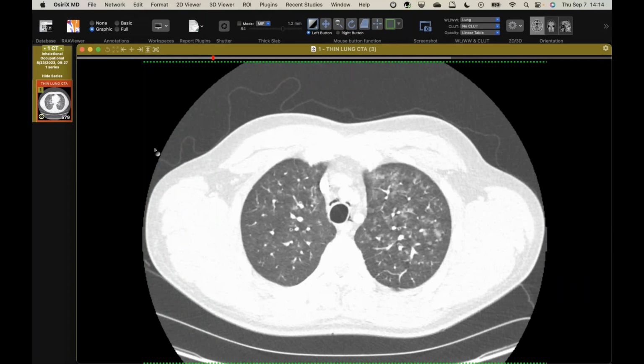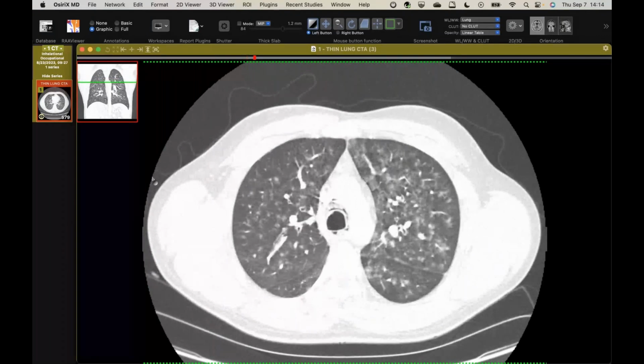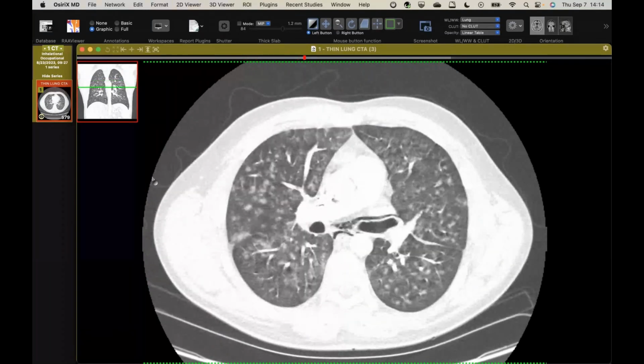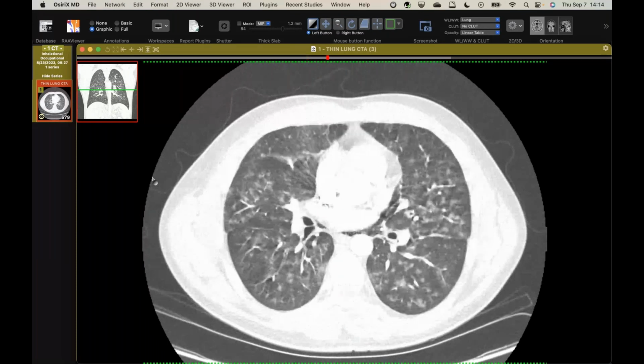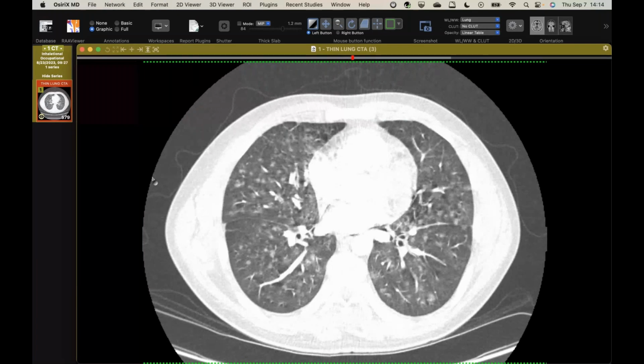It can be caused by exposure to certain metal oxides, but it's sort of a vague term. They get this systemic response, and they can get a little hemoptysis, and they can present with this centrilobular pattern, sometimes a little bit of edema. I presume the pneumomediastinum was just a Macklin effect from a lot of coughing, but I don't know. I haven't seen really any cases of metal fume fever, but this seemed to fit the bill. So a presumptive diagnosis of metal fume fever in a guy who works with a lot of metals that vaporize. I think he welds a bunch of them too.